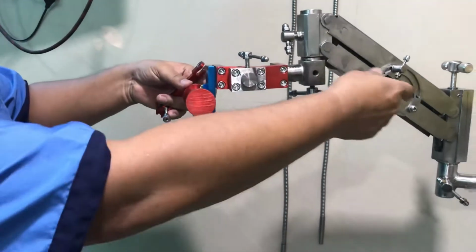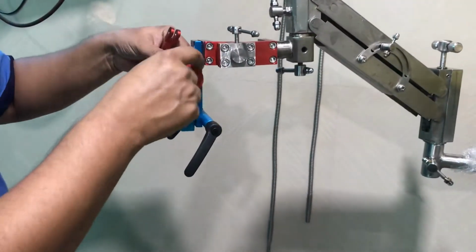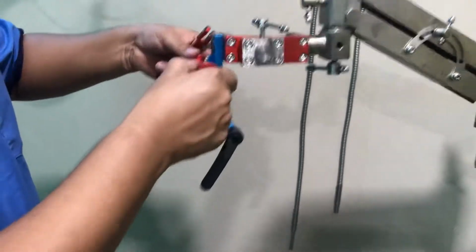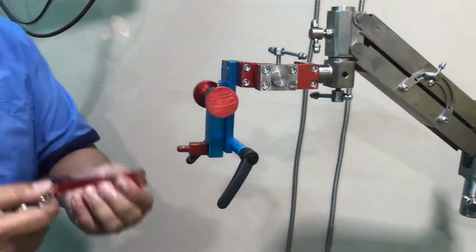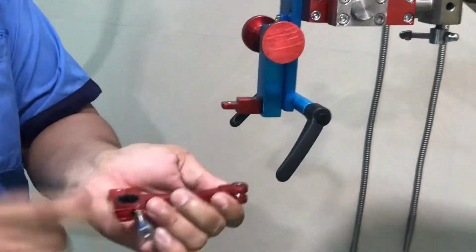EndoHold GS, that is, which is having the rack and pinion and gas spring. So this is EndoHold GS201 B. So how to attach the different endoscope holding attachment?